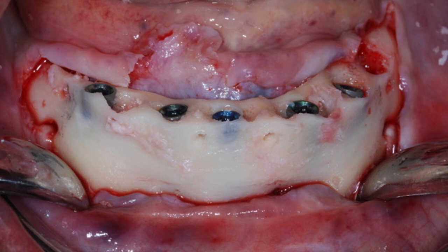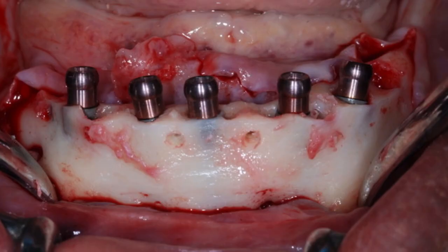We're doing it all on five here. She's a double zygoma on the upper left. She's got pre-existing implants that were done 10, 12 years ago on the rest of her ridge in all zirconia and ceramic. So we want to make sure that we've got enough structure on the bottom to be able to hold that ridge. So we're looking at the implants.